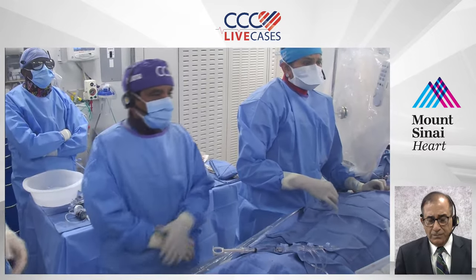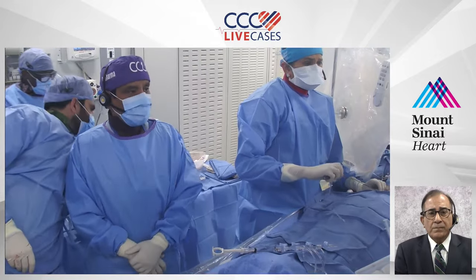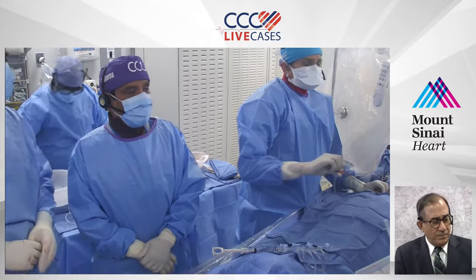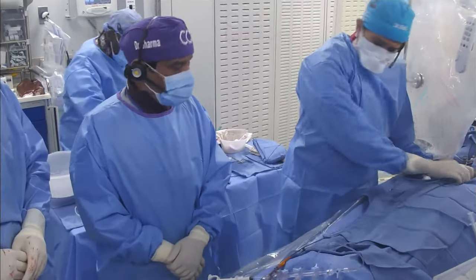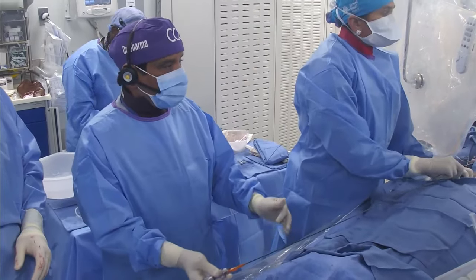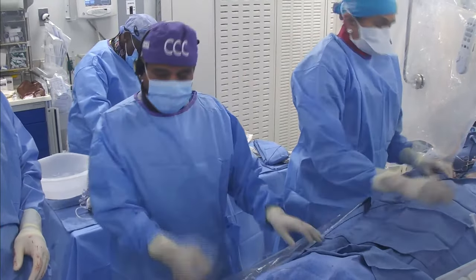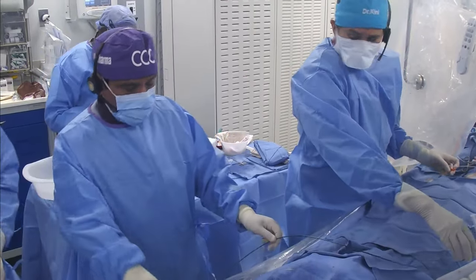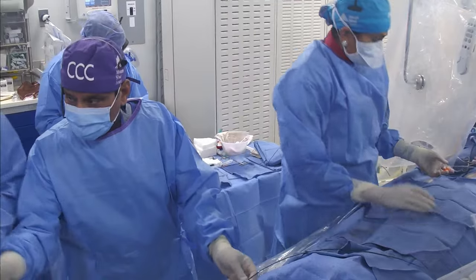As you see, we always try to use a long sheath in a complex case. Long sheaths were used here. Why do we use the long sheath? Because it gives you more steady guide performance. So usually, this is what, 35? What sheath did we have? 25. So this is 45?